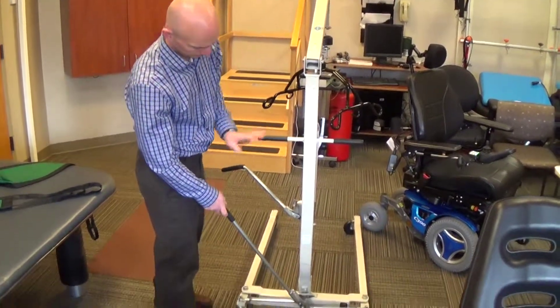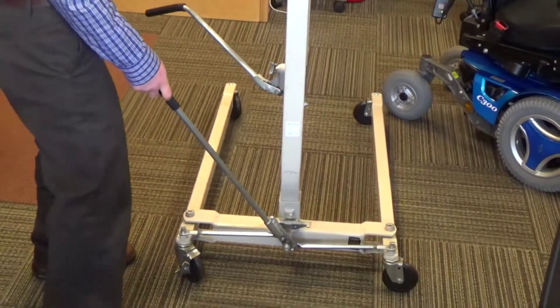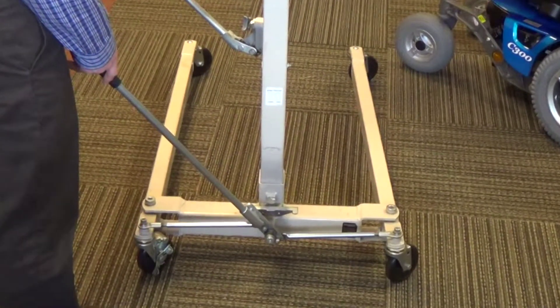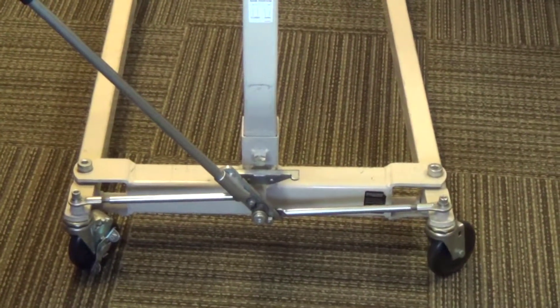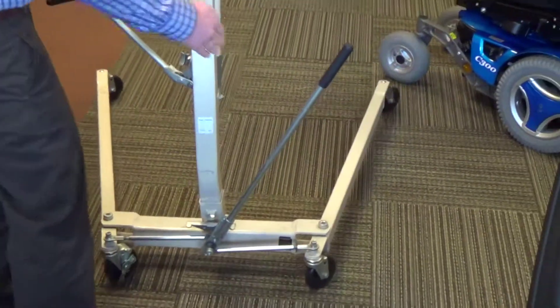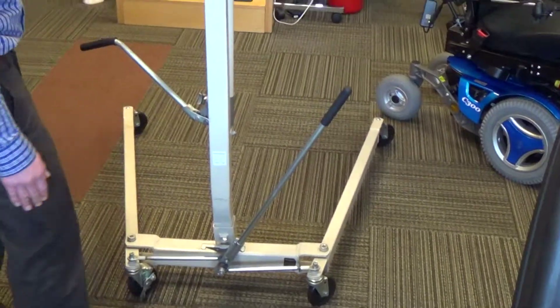On the bottom, there's another lever arm, and this acts to close in the bars of the base when you need to slide under a bed or get into narrow areas. You can also use it to open the base bars to get around a wheelchair or a toilet.